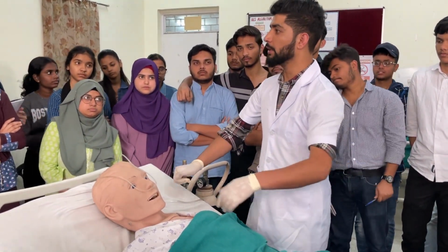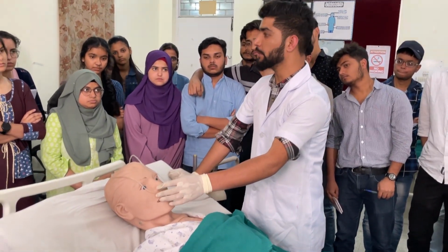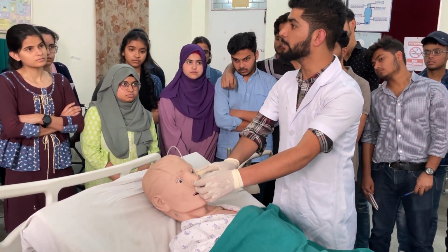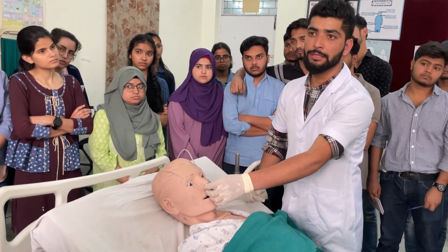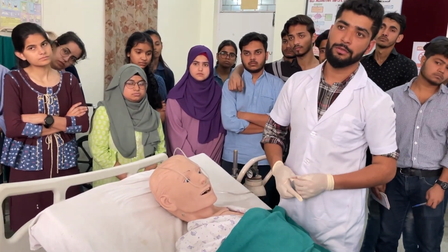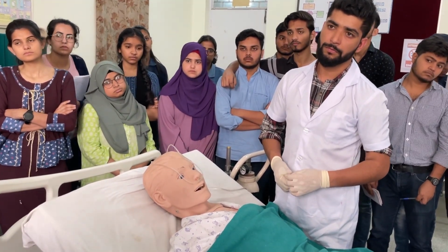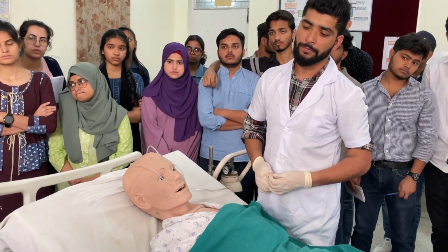When we provide constant oxygen therapy to the patient, after that, when we have to discard this, we stop this oxygen therapy according to doctor's order. Document. For some patients, it will be 2 hourly, half hourly, or for 1 hour it will be given. But for certain patients it will be given continuously also.